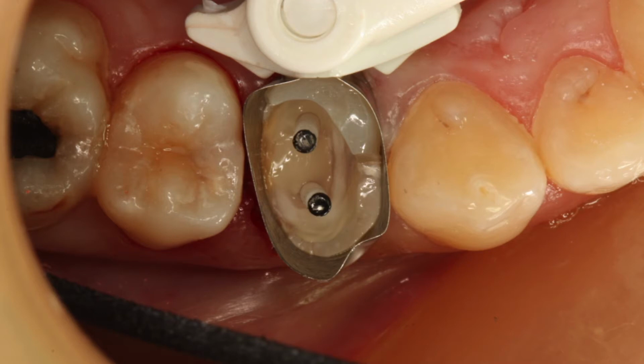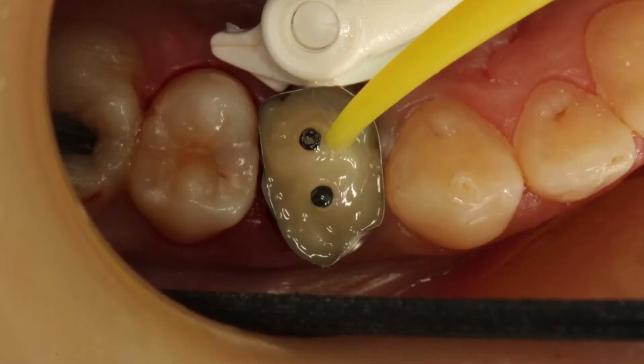Right, and so just to make that point, you're using the build-up material as the cement material, as opposed to using a separate self-adhesive resin cement to put the post in and then using a composite build-up on top of that. The bond strengths are probably better because I'm etch priming and bonding down that post space. And if you do it quick enough, you can squirt the material into the post holes, put the posts in, cure it for 5 seconds, and then still be able to use that same syringe without having to put a new mixing tip on. Yeah, it's not going to set in the tip for about 2 to 3 minutes. Right, and that's what you're doing there. You're doing your bulk fill, the rest of your soft serve ice cream, as we call it, as you go around those posts.